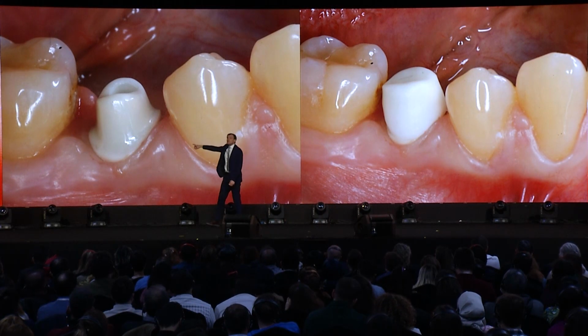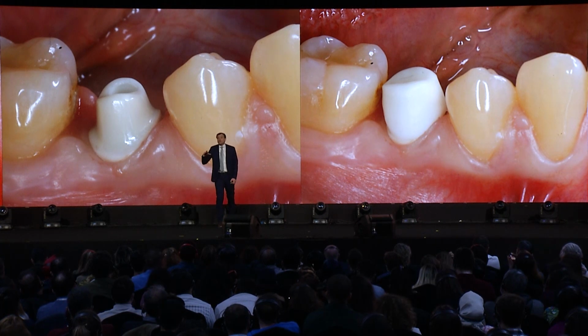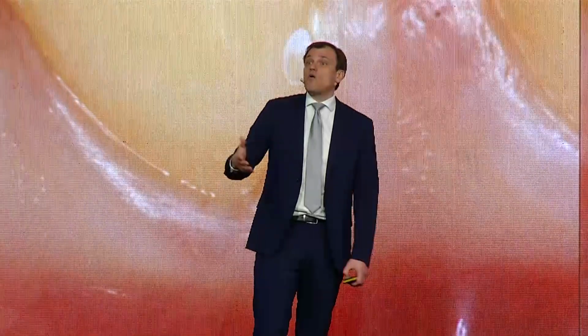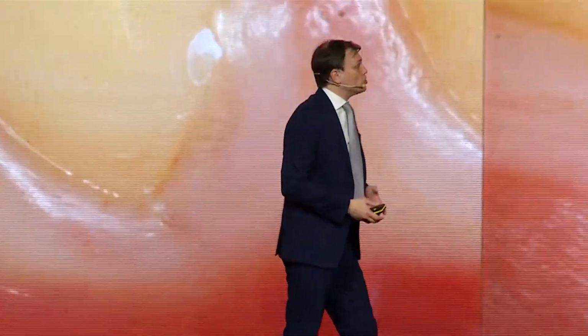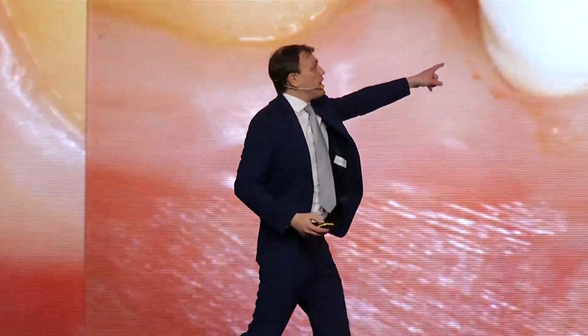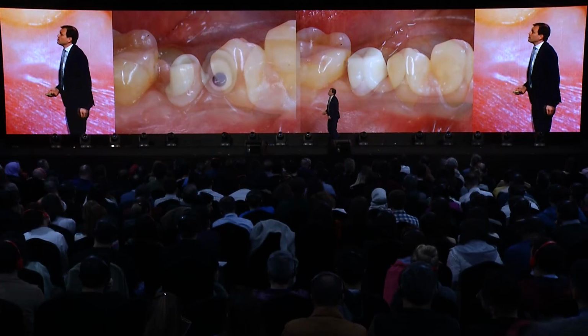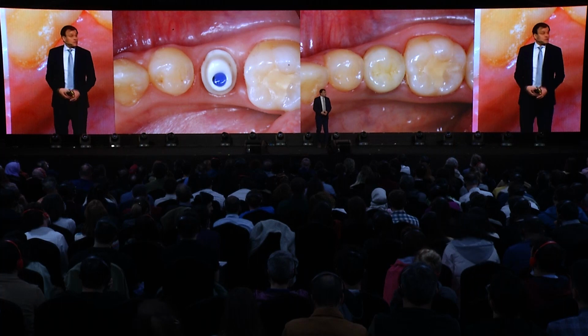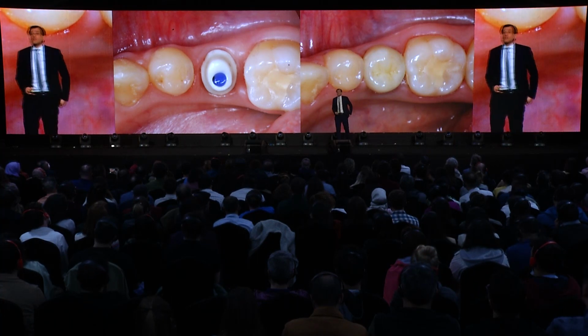Here you can see individual zirconia abutment. At that time, I was still doing cemented restorations. Now I'm 99% screw retained. Now in this case, I would do just a screw retained restoration, that's all. Well, but we change with time. So the plan was making zirconia and then a zirconia porcelain crown, like on teeth. This is what was done. You see the abutment, and you see the crown was cemented on this zirconia abutment.